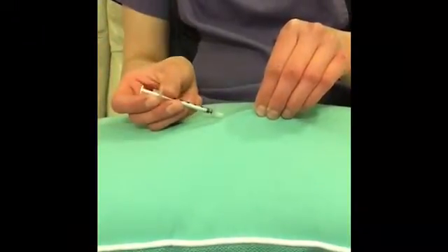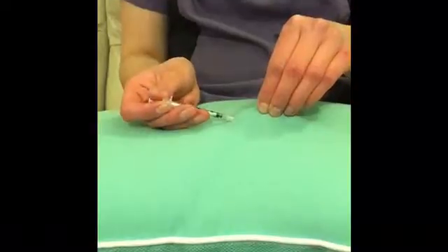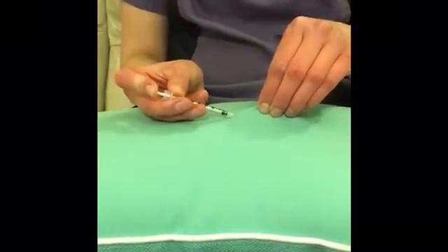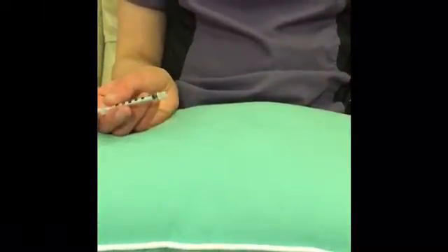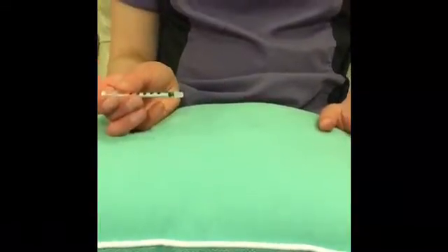We've pulled up on the skin, injected the needle into the hollow part of the tent, pulled back, there's no blood, and we are okay to give the injection — just like that. As you become more comfortable giving subcutaneous injections and are aware of the space underneath the skin, oftentimes you don't have to draw back, but that takes a lot of practice.